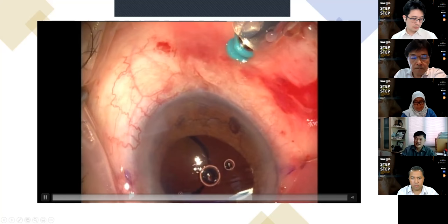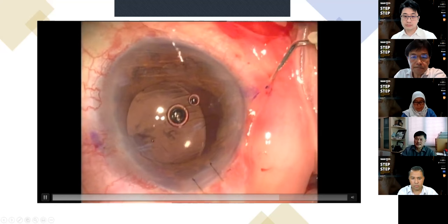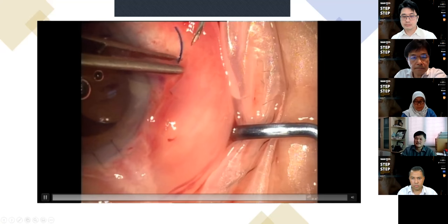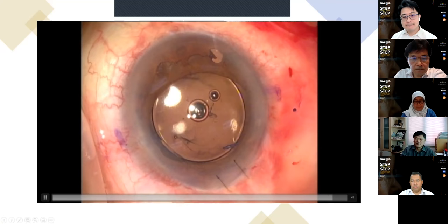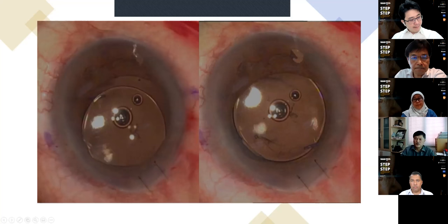And now the haptic is then externalized. So as you can see, I try to externalize in a horizontal manner. Okay, I don't lift up the needle. So once externalized, again, cauterize it to form a flange and then reposition the haptic into the sclera. So now you can see, if you want to compare, this is before and after, then you actually can see that the optic is being adjusted and now it's more centered compared to before the adjustment.